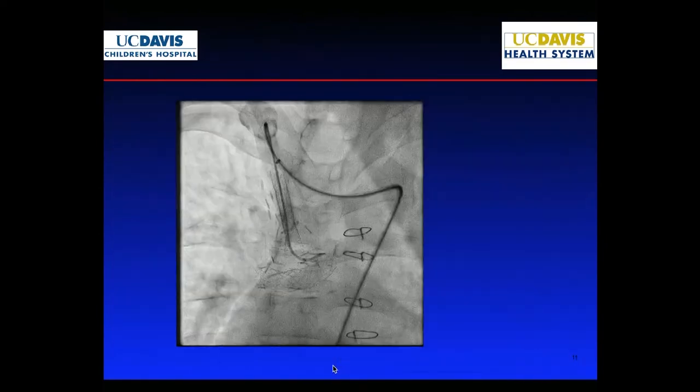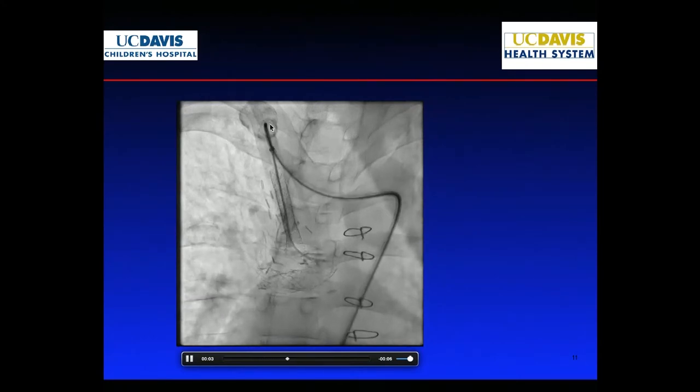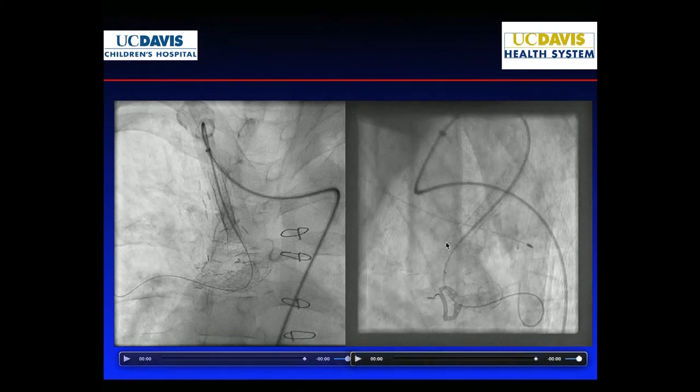So then you have to start all over again. So again, we eventually were able to get a stiffer system. I said, let's just go ahead and get the sheath into here so you can anchor that to go deeper. But see how, as you're pushing, the sheath just backs itself up. And we finally get a wire all the way down, but we were never able to really push at getting this catheter through so I can put a stiffer wire in place, just to show you.